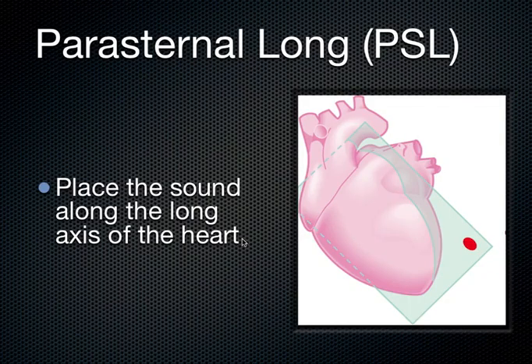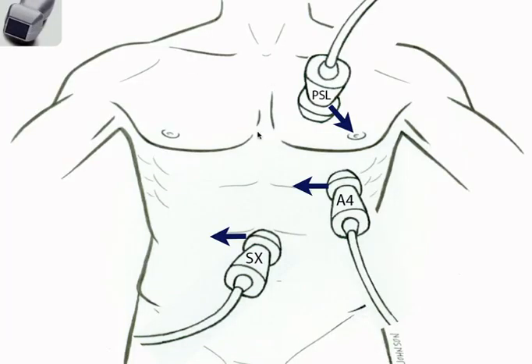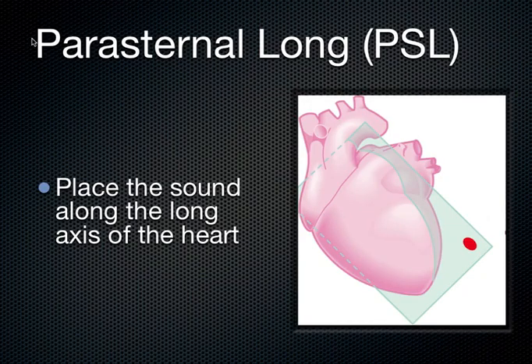To go through these in a little more detail, the parasternal long axis, again, as its name suggests, parasternum, you've got the probe right next to the sternum. So if the sternum is right here, you've got the probe. I actually put the probe on the sternum and then just slide it off a little bit, aiming the indicator toward the patient's left if I'm doing the parasternal long. And this is what the transducer looks like that we use. It's the P21 or phased array, small footprint, 21 millimeters of footprint there right along the parasternal region.